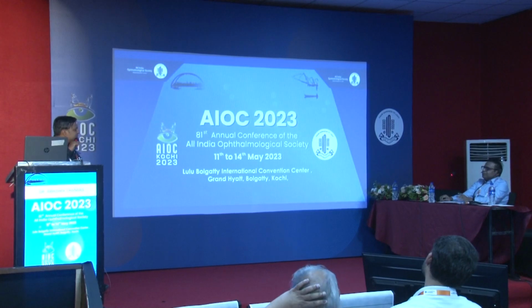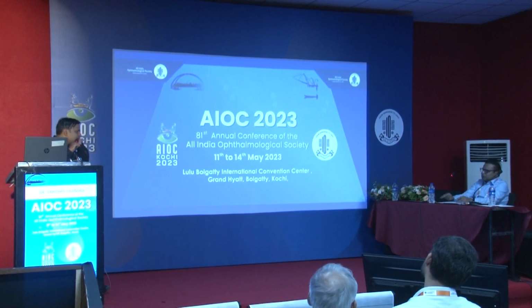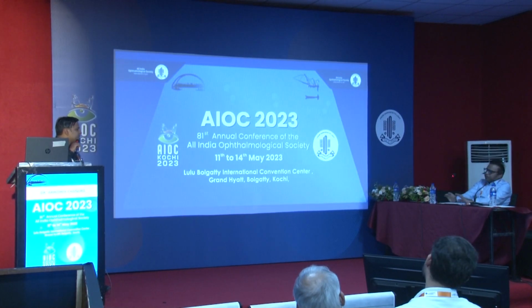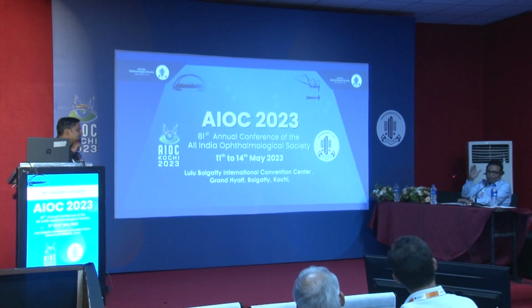Number 2 is the haze, post-op haze. Yeah. Haze is mainly because the post-op tapering of steroid is very fast, not adding cycloimmune, and lubrication is not adequate. Mitomycin definitely gives advantage over that. But the most important challenge is the post-op 2 to 3 months, how we manage the case.